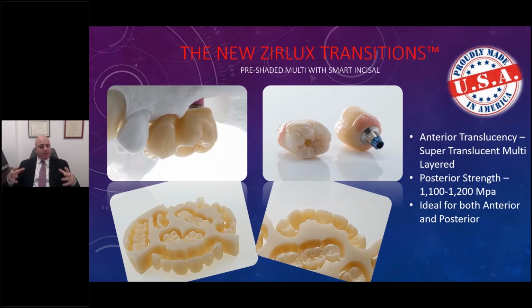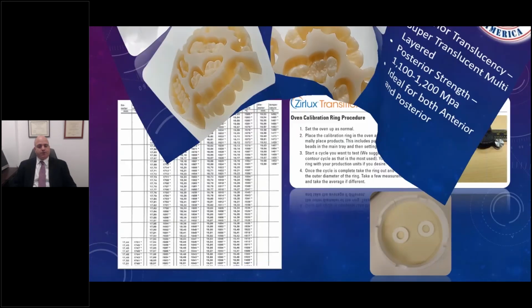So here on the bottom, going back to the way it was pressed, it's pressed with a hybrid colloid, as I said. It's pressed differently. It's under suspension, and there's a reason why they do that, because then it can be processed so there's a greater level of yttria at the incisal, and the blend becomes gradation rather than multi-layer. It's also a much, much denser zirconia, which means the shrinkage factor is a little smaller, and it's a little bit tougher because it's a denser material. But all throughout you have a true color due to that process. So it's really an impressive process.